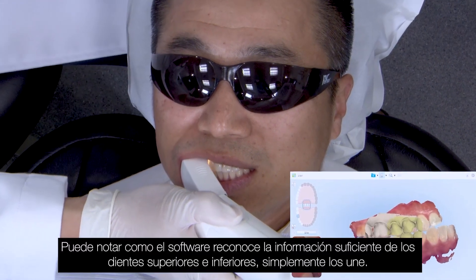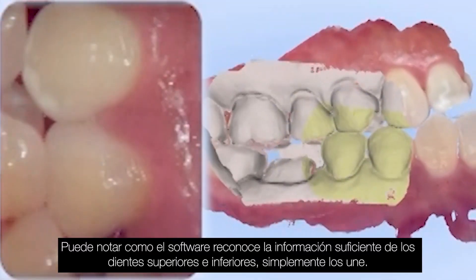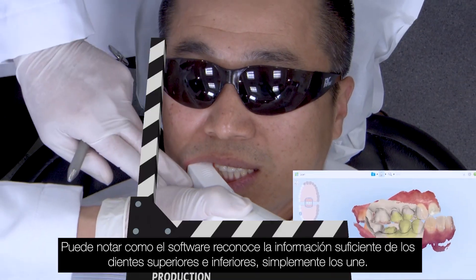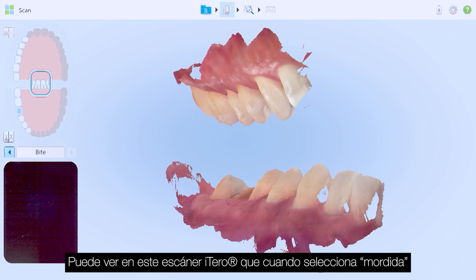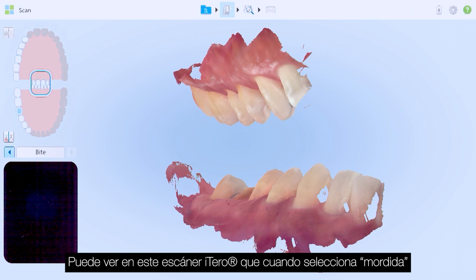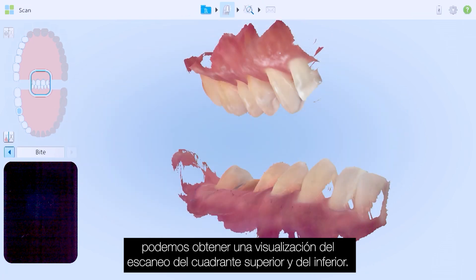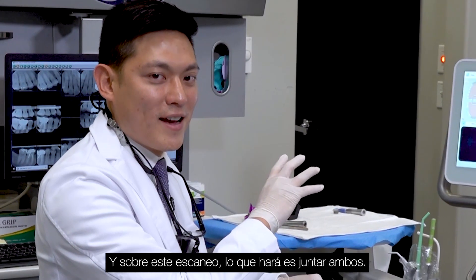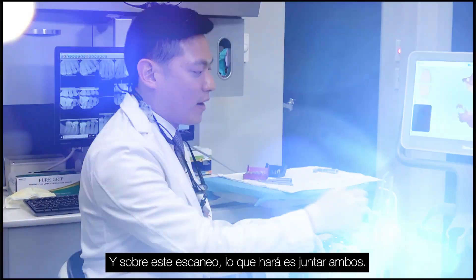You can see once the software recognizes enough data from the upper and lower teeth it just brings those together. Let's go to the bites section. On this scanner, with the iTero, when you select bite, we have a visualization of the upper quadrant scan, the lower quadrant scan, and what it's going to do is just merge those together.